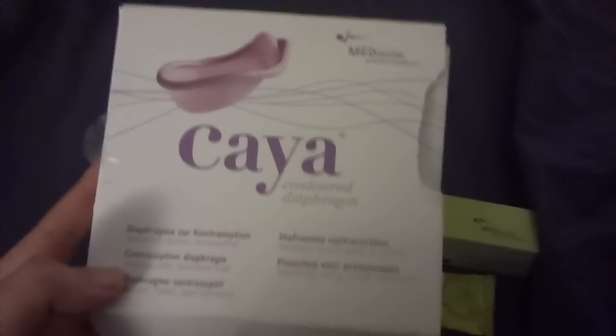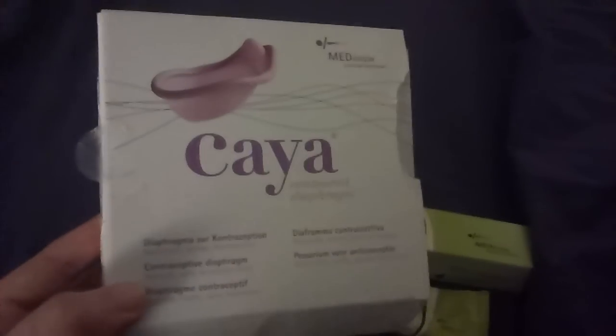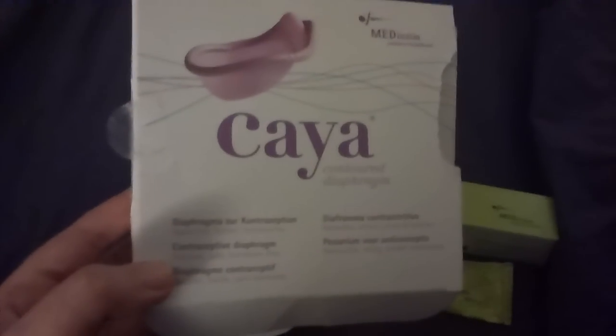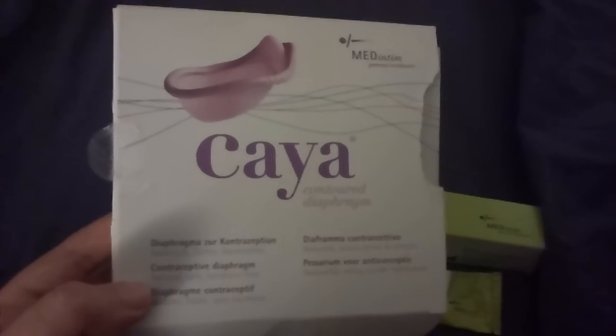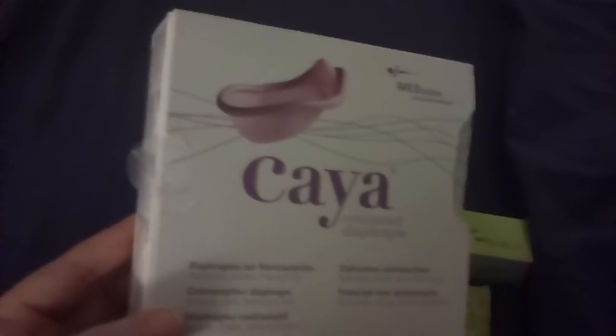This was from femininewear.co.uk and cost approximately £40. We decided to try using a diaphragm because hormonal contraceptives don't work for me, and we can't use condoms as often as we'd like because he has circumcision scars which get sore, and condoms make that worse.